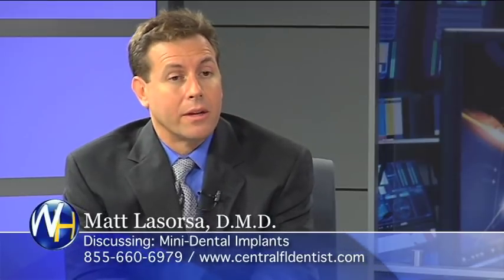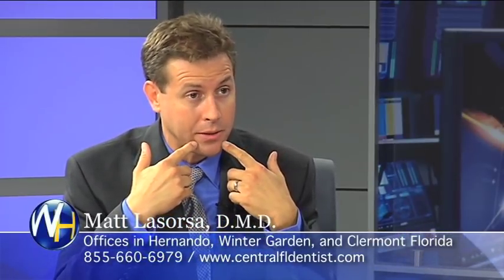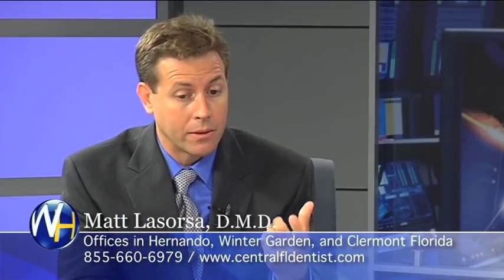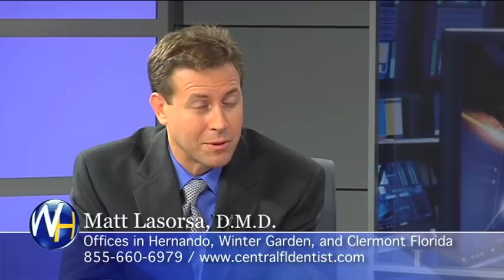They come in, we have a surgical stent that tells me where to place the implants. In the lower, we place 4 mini implants. In the upper, we place 6 mini implants. And then we have the housings to snap on. They can put a full arch of teeth in and walk out in the same day and go eat whatever they want. Are they surprised to hear this, by the way, on the consult? Yeah, sometimes they're in a little bit of disbelief that it can be done.